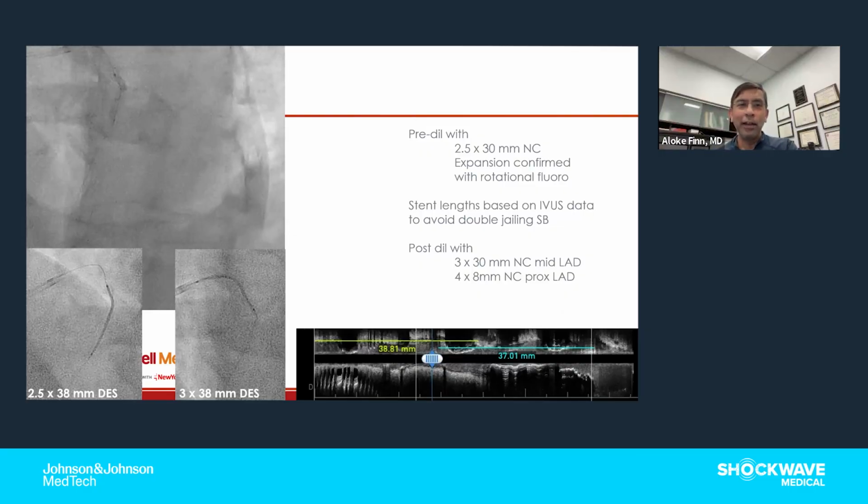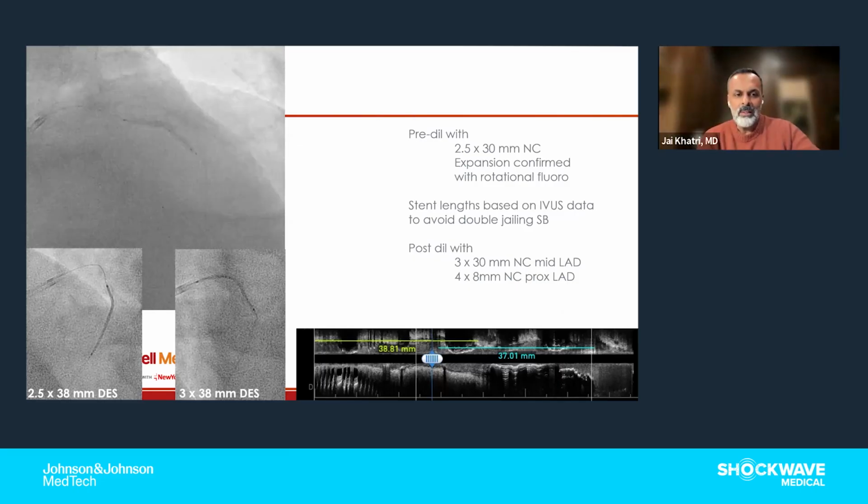I don't like that angle. I think it'll be easier if you IVL it, my personal feeling, but maybe make the procedure easier. Yeah, okay. And that's sort of the debate.